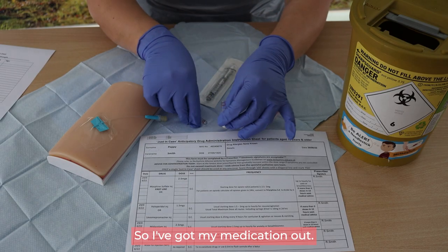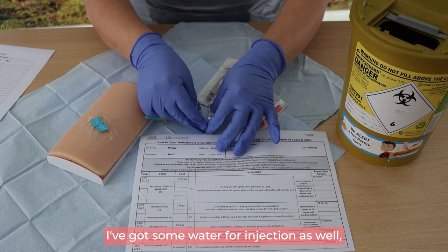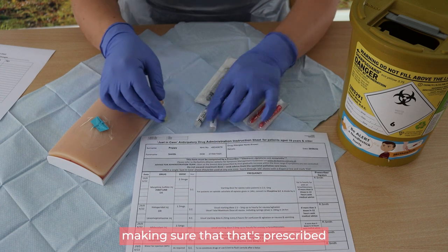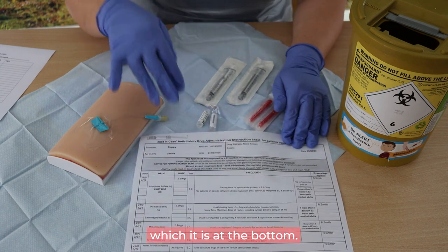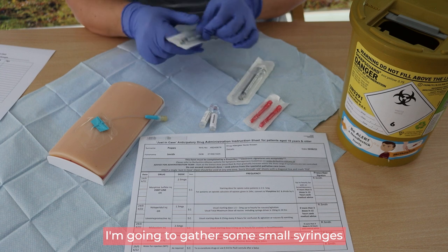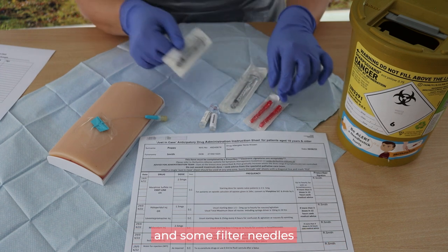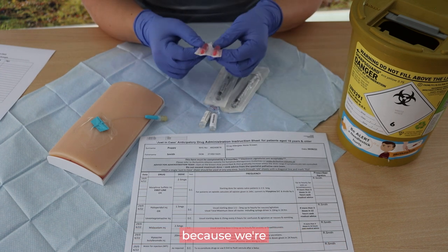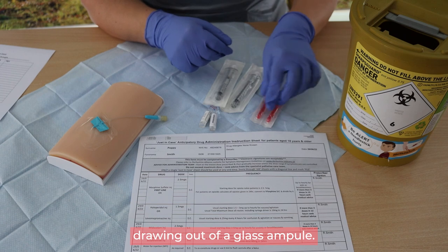I've got my medication out. I've got some water for injection as well, making sure that that's prescribed on my directive, which it is at the bottom. I'm going to gather some small syringes and some filter needles because we're drawing out of a glass ampoule.